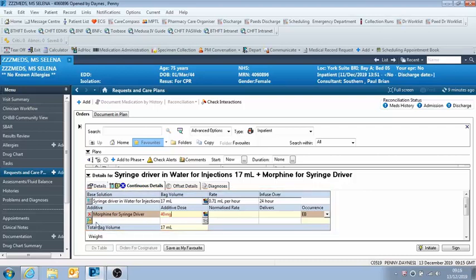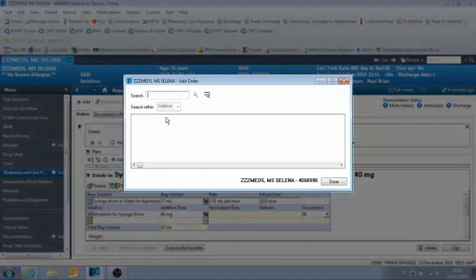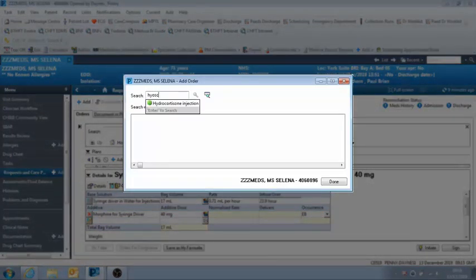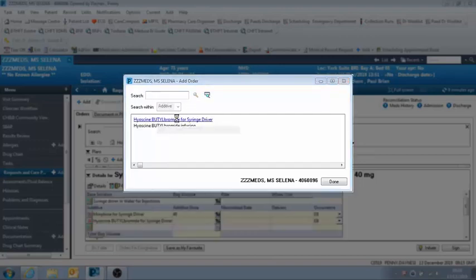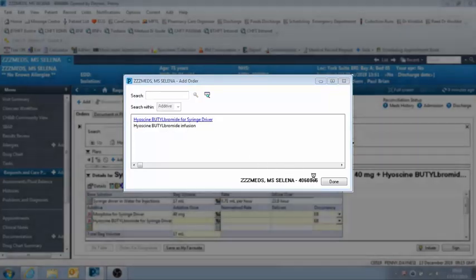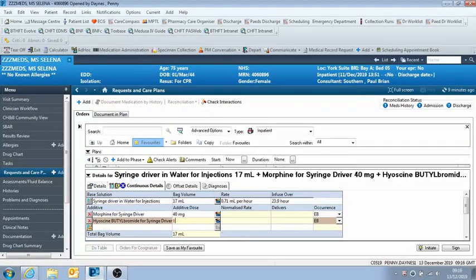And then to add more drugs, you just keep clicking on this additive box. So we'll just click that again. And then this time we're looking for hyoscine butyl bromide. So again, click on the advanced search box, and we're looking for the drug for syringe driver. And then done. So then here we can type in our dose for the hyoscine, 60 milligrams.